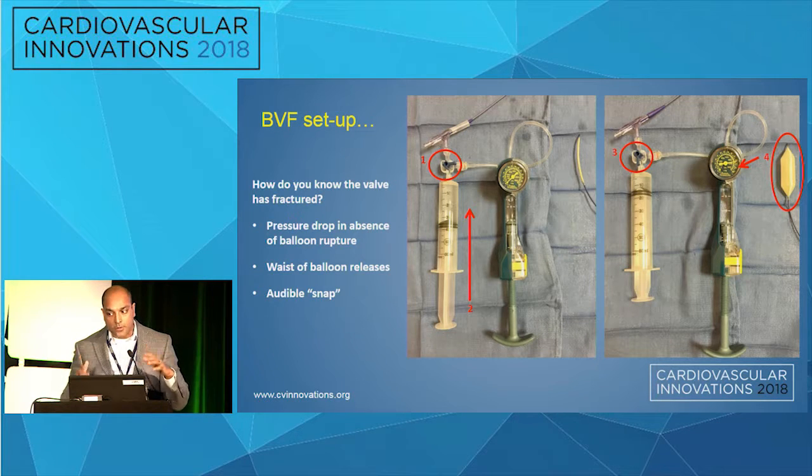You shouldn't be concentrating on the fluoro or the cine to look for the waist of the balloon to release, because it can be very subtle and you'll miss it. You can look afterwards and see that. Sometimes you'll hear a snap, but you can't rely on that. So it's very important that you understand that the pressure drop tells you you're done.